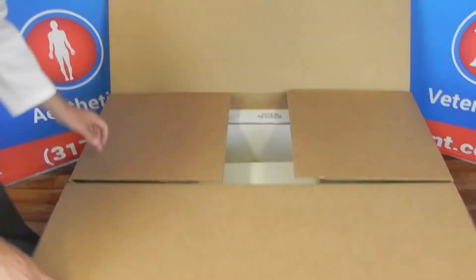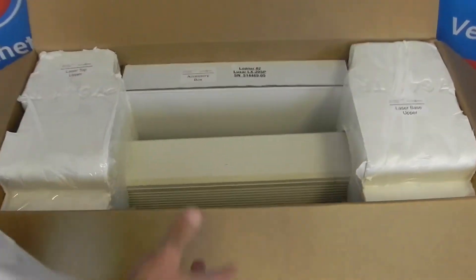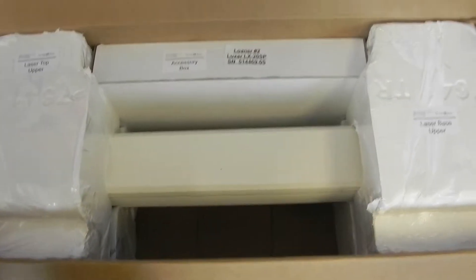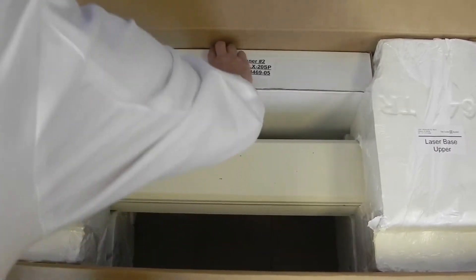Open it up and this is what will be inside. If you purchased it with a waveguide from us, it would be here as well, but if you're just getting it back from service, you're going to keep your own waveguide. The accessories will be in here and your laser will be packed in here.